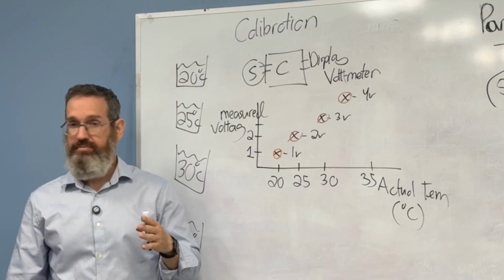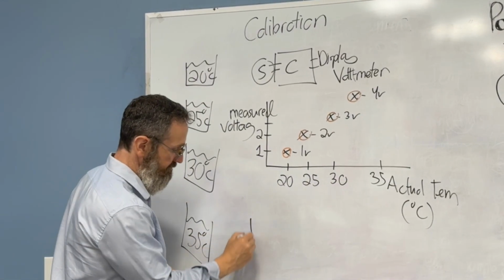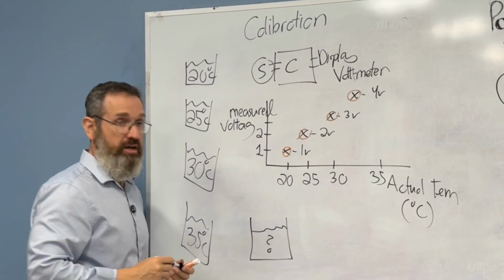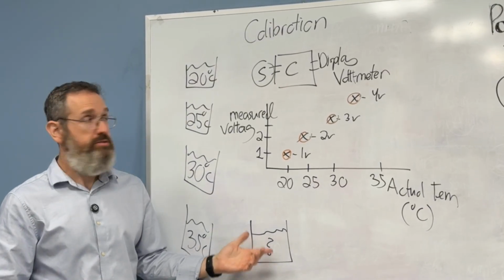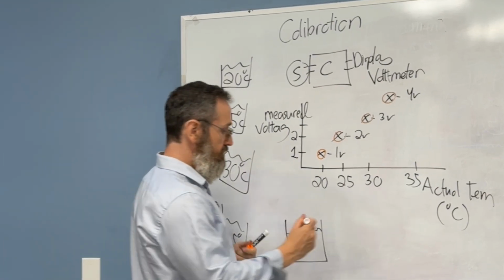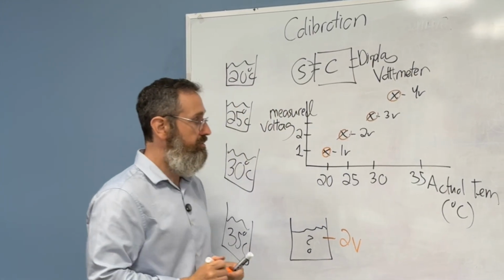Now, you come to a new sample, and you don't know what the temperature is. So you dip your device inside and you measure 2 volts.